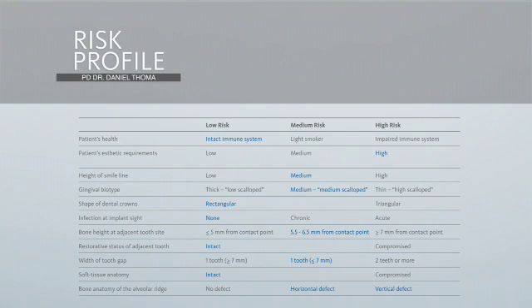Looking at the teeth, they are rectangular and we do not have an infection at the implant site. The bone height at the adjacent tooth side ranges between 5.5 and 6.5 mm from the contact point, which is of medium risk. The restorative states of the adjacent teeth are both intact, and the width of the tooth gap is about 7 mm.